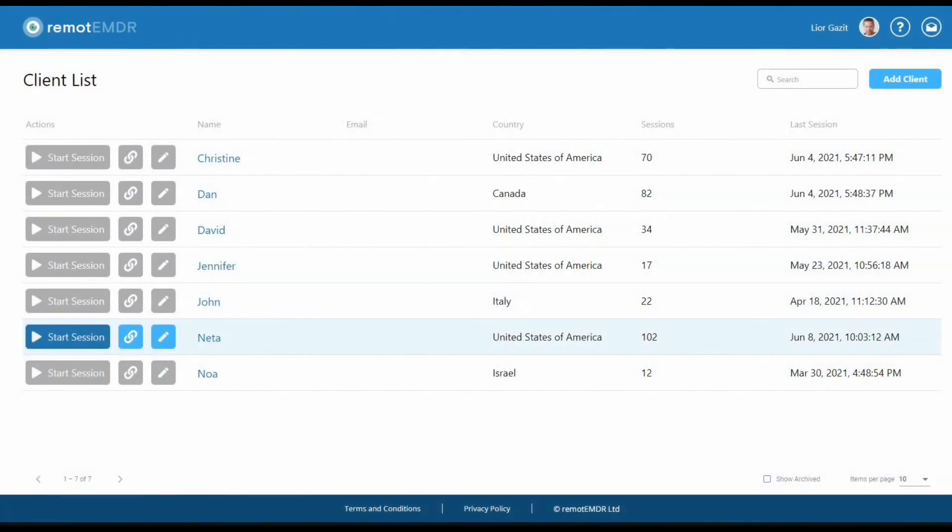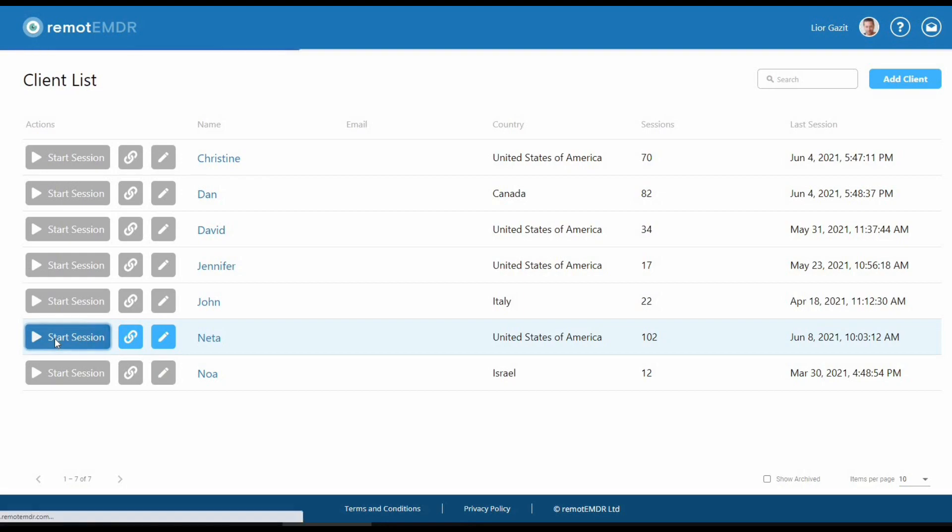That's it. You're ready to start your in-person EMDR session. And remember, Remote EMDR offers many customization options.